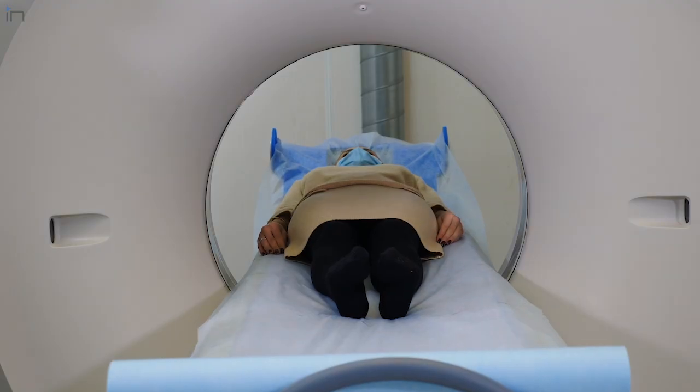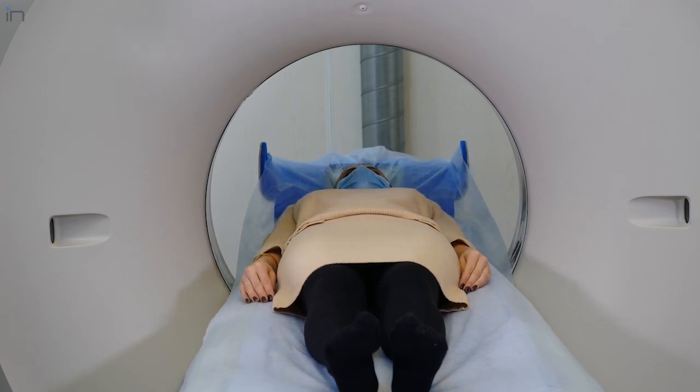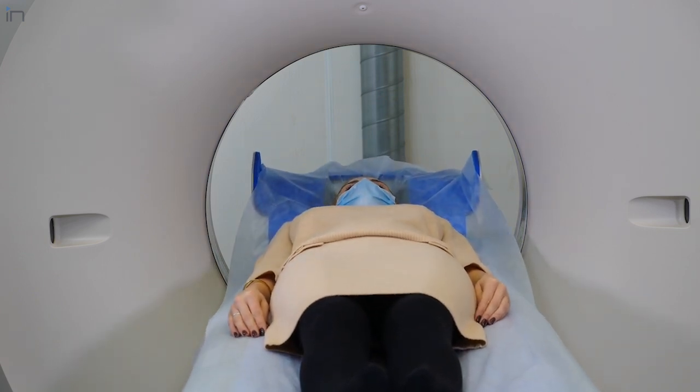There are several different segmentation softwares out there. So right now, say if unfortunately you had to go in and get a scan for some reason, whether it was through a CT or an MRI scan, that collects what we call your patient DICOM data. It's a digital data set from your actual scan. There are softwares like Siemens software, maybe Materialise, Synopsys. There are companies out there where you could take that DICOM data set and convert it into a 3D printable model.